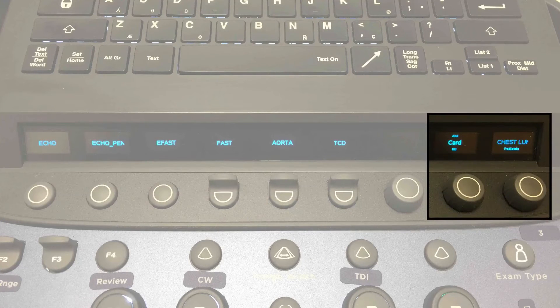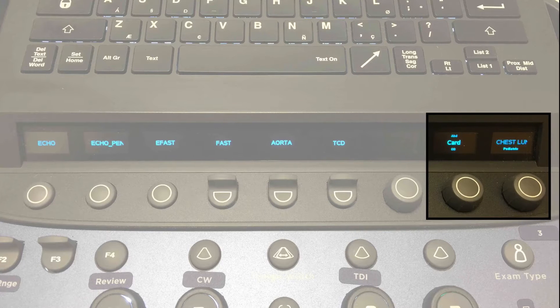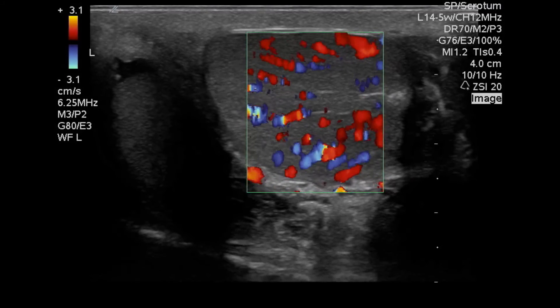If you need to select a preset that is not in the quick select, you can use the dial to scroll through between cardiac, OB, abdominal, and specific sub-presets — such as abdomen or a lung preset. Then you can select your preset and start scanning.